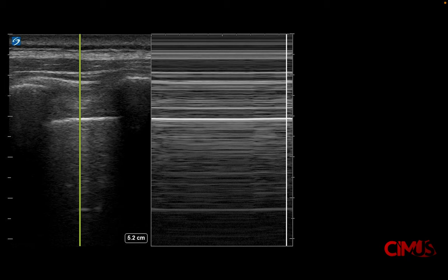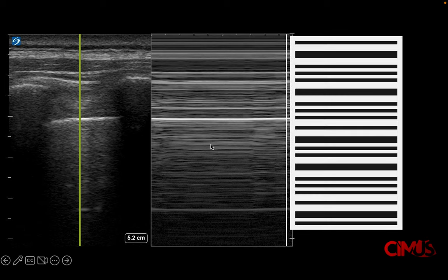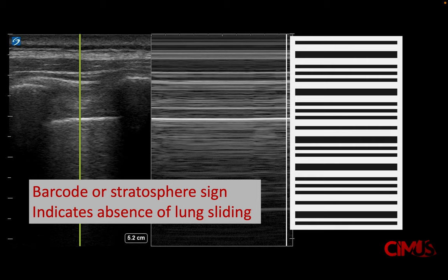This slide shows the barcode sign, where there is absent lung sliding. On M-mode, the pleural line is visible, but you see absent movement both above and below the pleura. This is termed the barcode sign or stratosphere sign, indicating the absence of lung sliding.